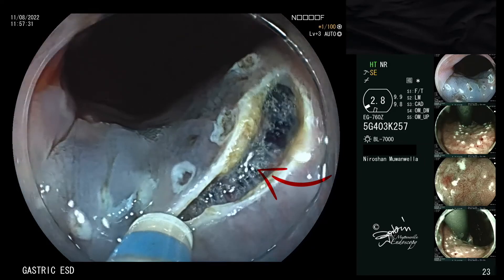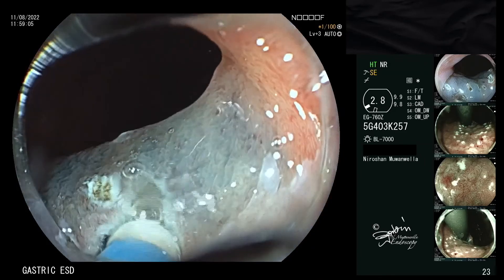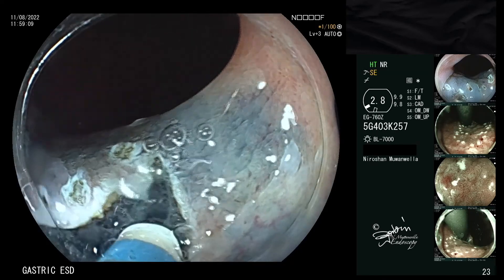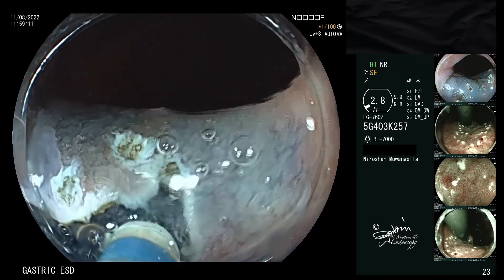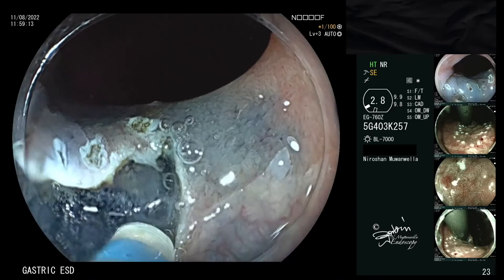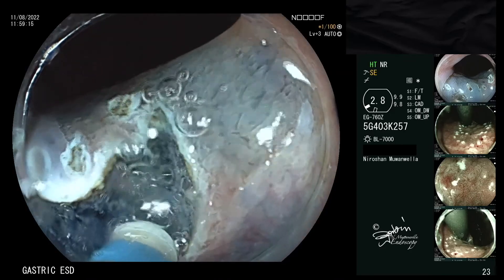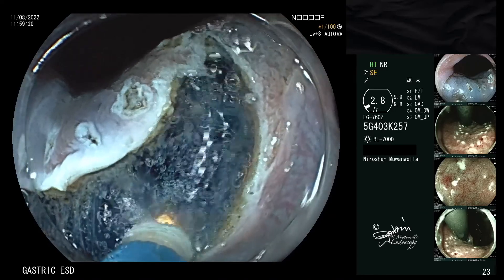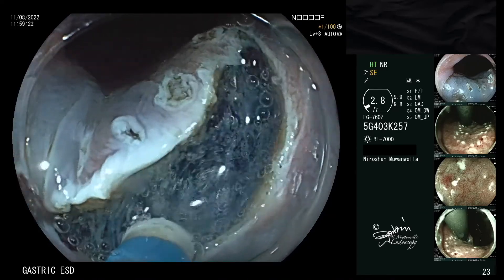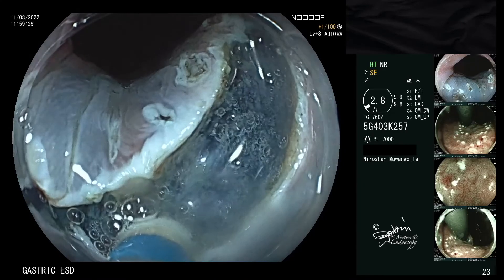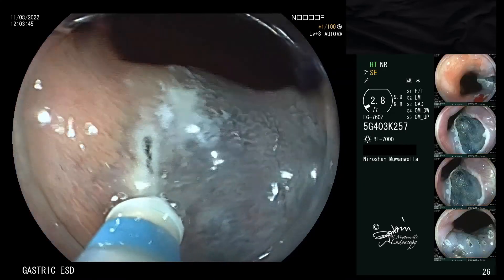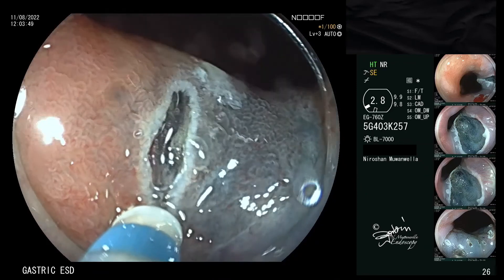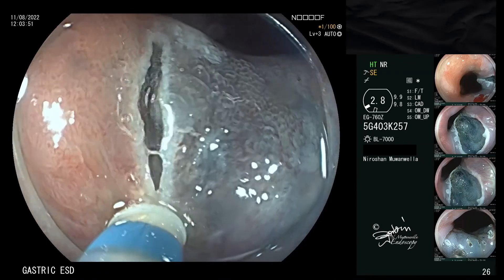What you can see here are the fibers of muscularis mucosa. Thereafter, it is very important to carry out trimming of the submucosa down to the muscularis propria. Here, mucosal incision and submucosal trimming is being carried out from the 9 o'clock to 6 o'clock orientation.